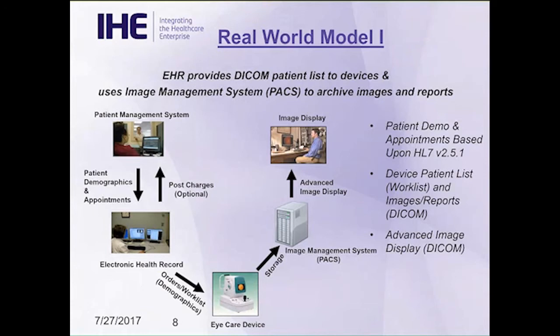So what happens is we've mirrored this workflow based on 3 models into the real world. And so the first thing that you have to do is determine which model fits your clinic. So if I'm a clinic or a practice, I have to look at the type of devices I want, the type of capabilities they can provide, and I have to determine which model fits me the best. So I'm going to cover those models, and there's 3 of them. As a vendor, you've got to do the same thing. You have to look at this and say, which workflows do I want to integrate my products to? And what you'll find out is, sure, you may only interface to one workflow, but in reality, you're most likely going to want to do multiple. So let's take a look.